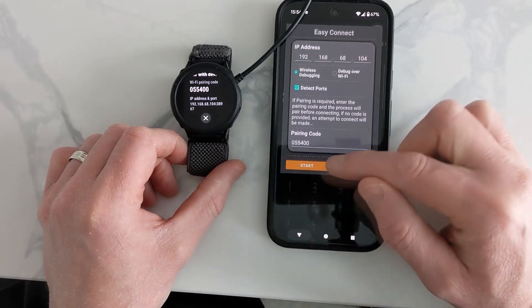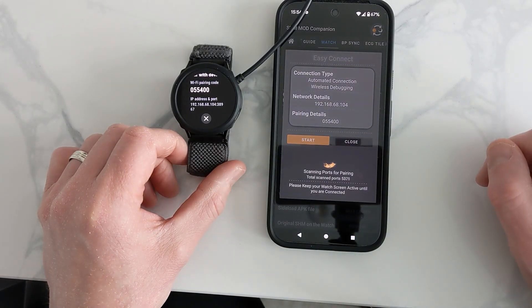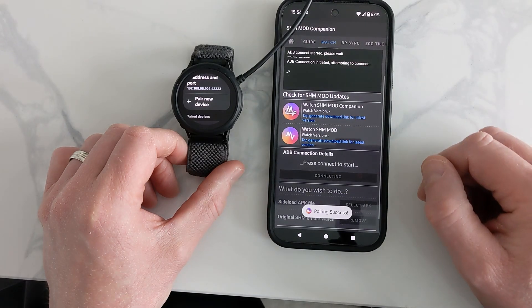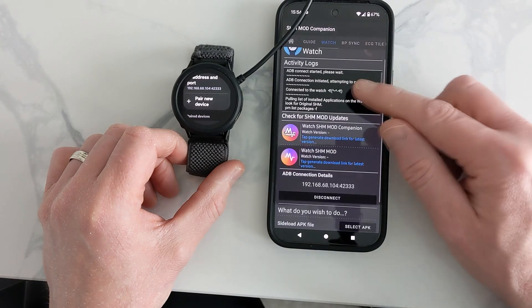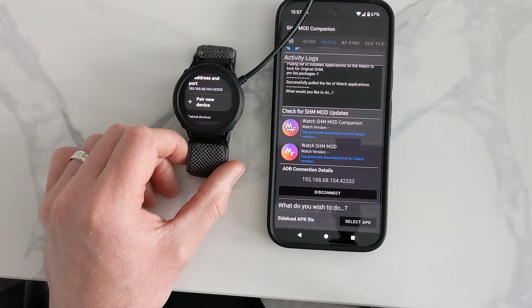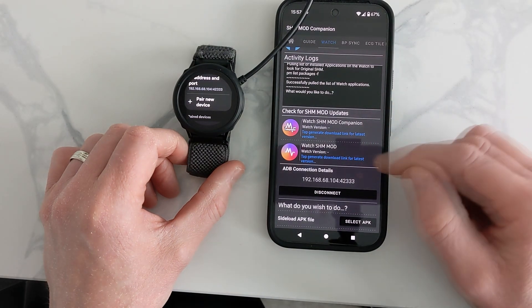Type that in and start — the watch will now look for the phone. You've got to be on the same WiFi, though I believe you can use hotspot as well. Now it's found it — press proceed — and successfully, we are done. That is now working.